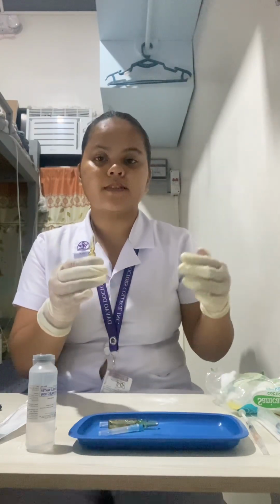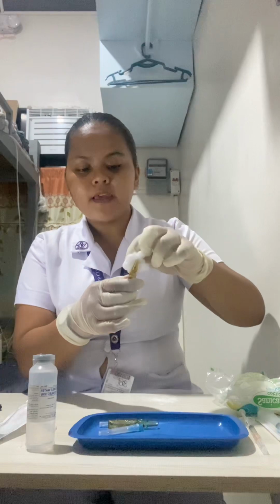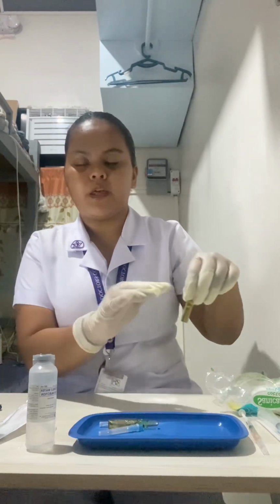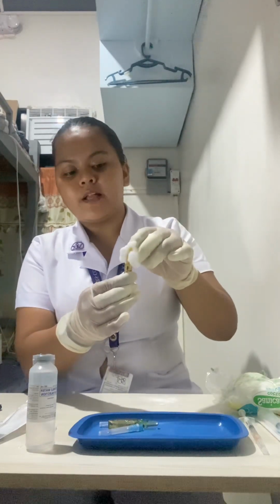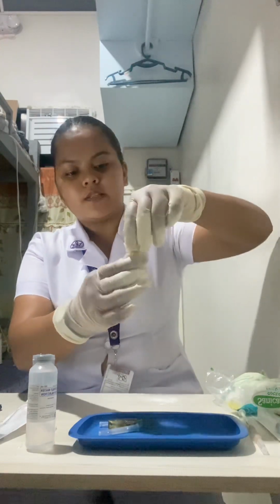I am now going to use an ampule opener, but since I don't have that, I'll be using this clean gauze or cotton to break off the ampule. In breaking the ampule, we have to make sure that we are pointing or bending it away from me or from any others. This is because we are breaking glass here, so we do not want the glass fragments to spread. Also, this clean gauze will keep my hands from being injured. So I'm going to slightly bend it off.